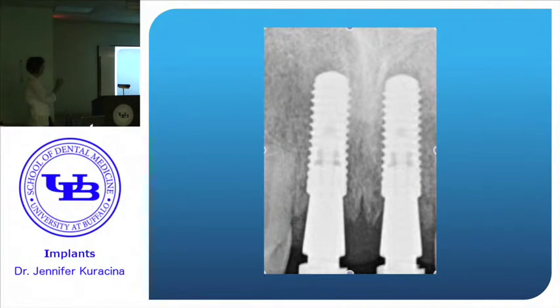You probably know that you can kind of feel if the coping is binding as you're trying to screw it in. So usually I'll unscrew the coping a little bit and screw it in myself just to get a feel for whether it seems to bind, because that clicks in my mind that I'm having trouble seating it all the way. So just be aware of the situation, and if it's warranted to take a radiograph, do so. If you're using the tissue level and you're using those plastic components, then obviously there's no reason to take a radiograph because you're not going to see anything.